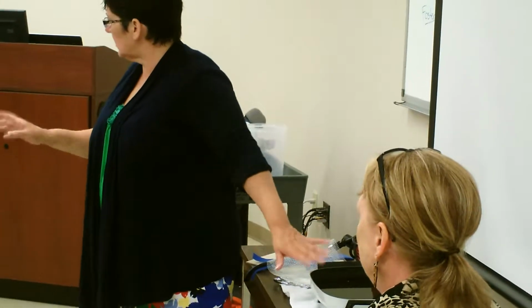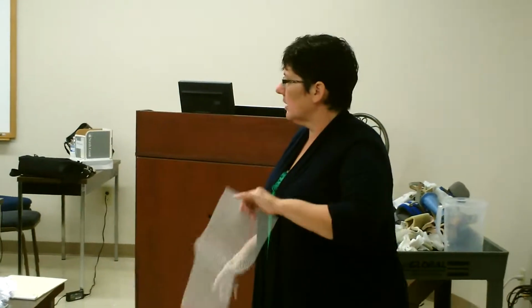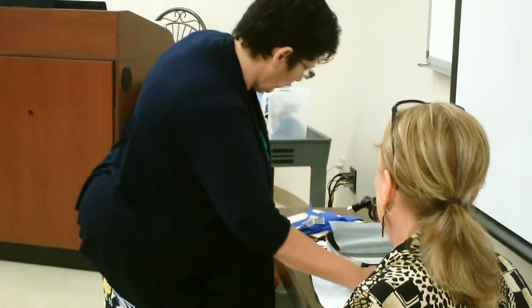You got your frying pan. When we get to the room, you'll have a big frying pan to work at. Set it to 200, 250 degrees. You have to have water, and it doesn't need to be sterile or anything. Okay? I like a little netting or a little spatula because it's going to be hot, so you got to be able to pick it up out of the water once it's hot. Okay? I'm going to keep this faster.